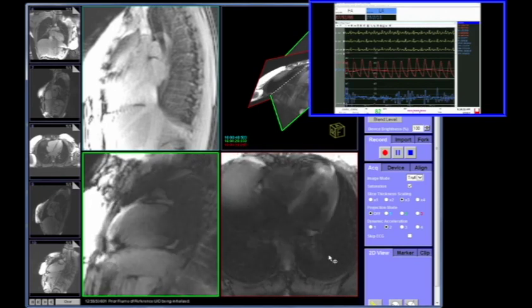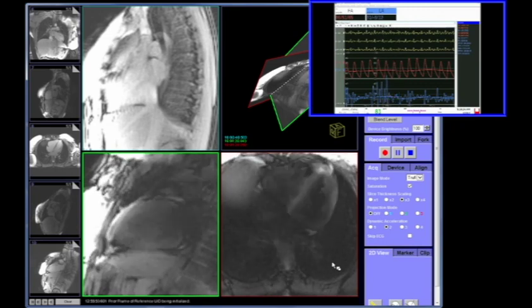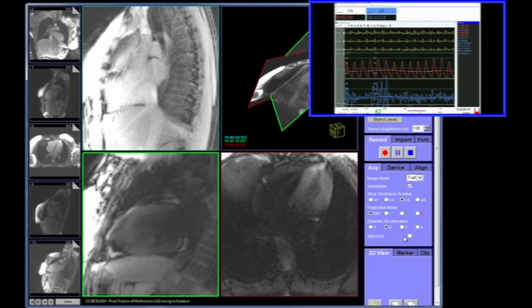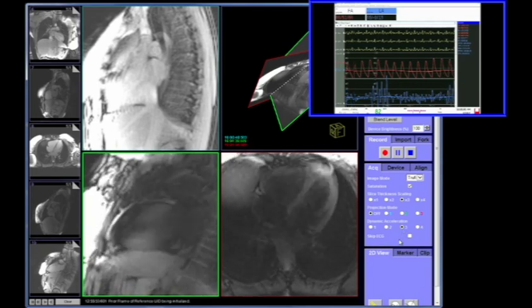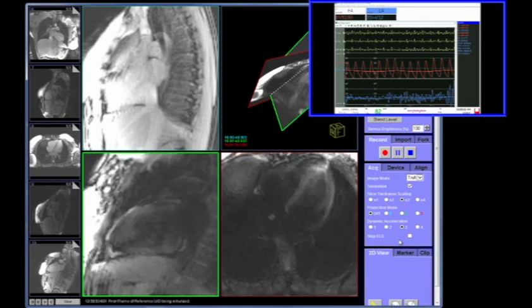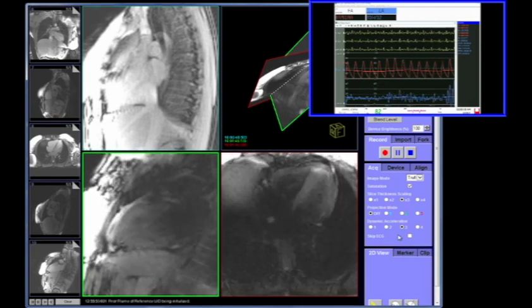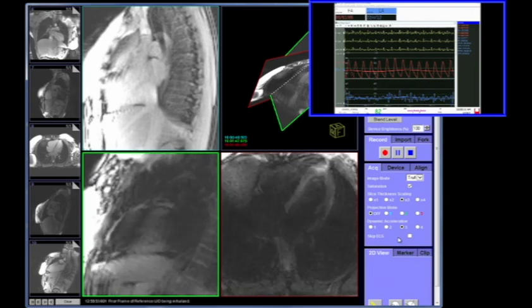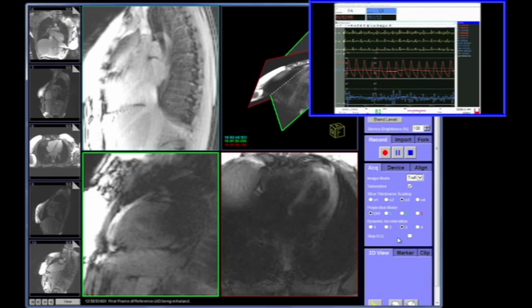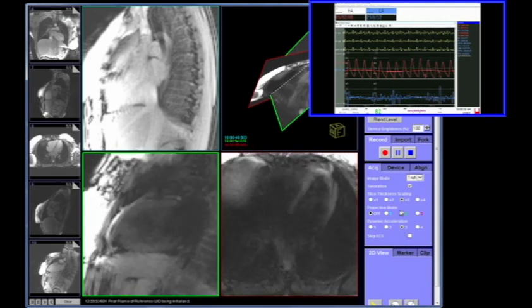So we promised you a right heart cath — we may get a left heart cath too. Sometimes this is a little hard to do with a floppy catheter, especially retrograde. As we said, this catheter's now been in the body for about 10 minutes, and the longer it's in, sometimes we just have to take it out and start with either a new catheter or literally cool the catheter down in a bath of cold saline. That gives us back some stiffness, torquability, and maneuverability.